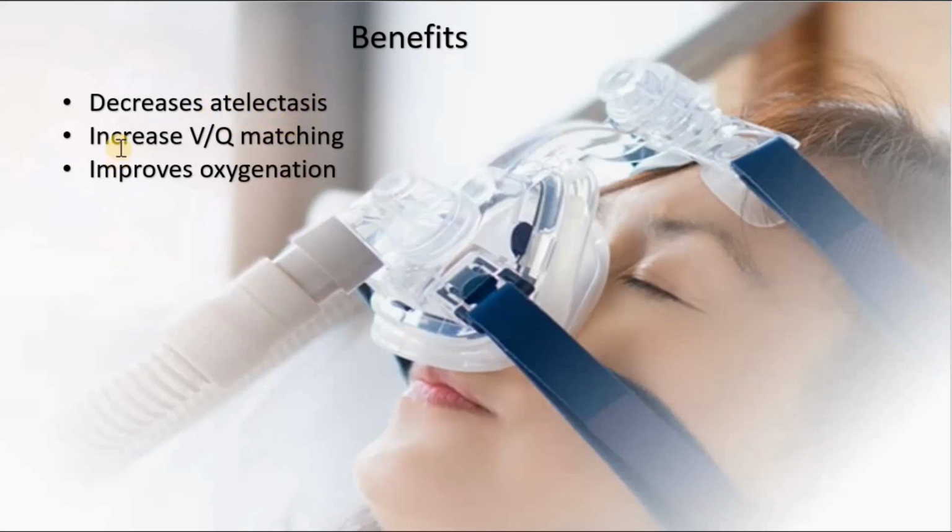Another benefit is increased ventilation perfusion matching. V stands for ventilation and Q stands for perfusion. So the alveoli remain open, more air moves in and out of the lung. As a result, the ventilation increases. When there is an increase in ventilation, what happens? There is good perfusion. You are increasing the ventilation. As a result, better gas exchange happens. That's called VQ matching. When VQ matching happens, better gas exchange happens. As a result, it improves the oxygenation of the patient.